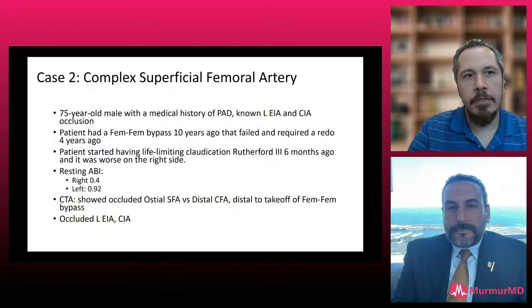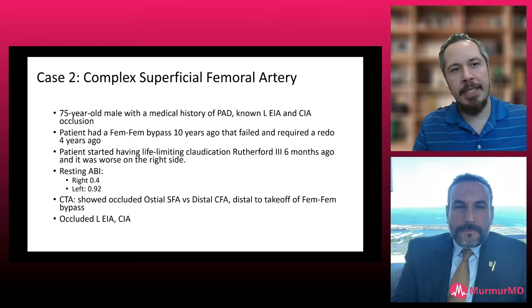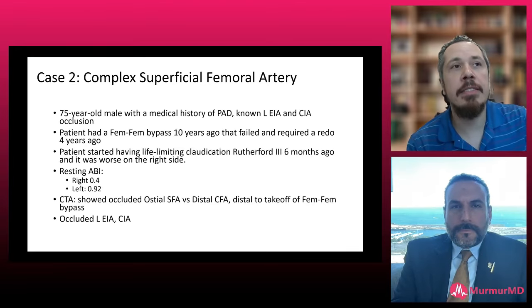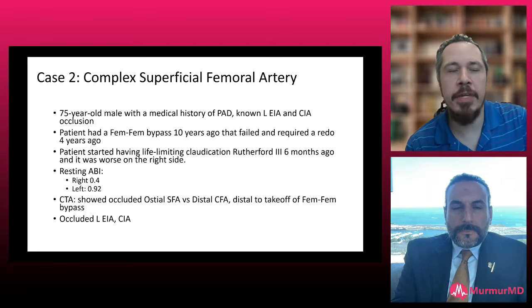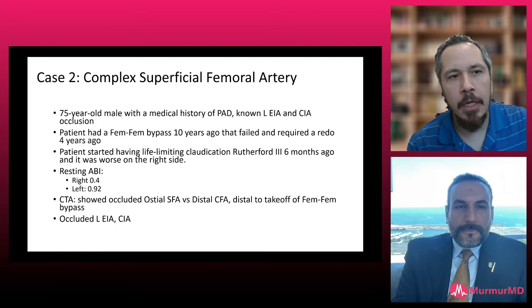All right. So let me pick your brain on this one now. This is a little bit more difficult. When we had this patient, I really had to think about it. And again, I'm sorry, guys. This is my passion. I'm going to show a lot of radial to peripheral stuff, but there's this utilization. It's just two cases that we pulled up here.